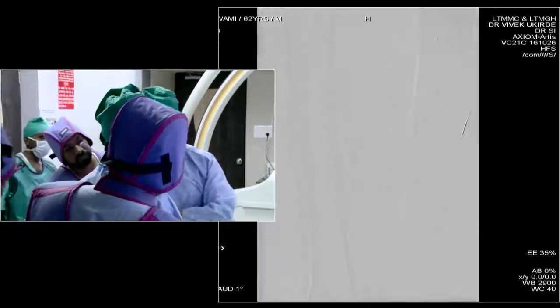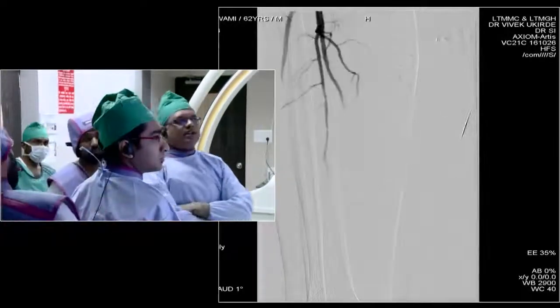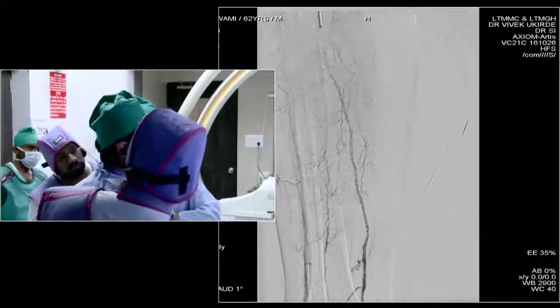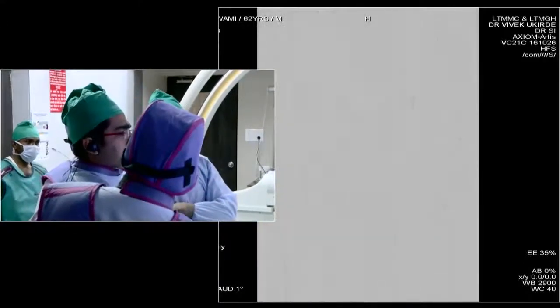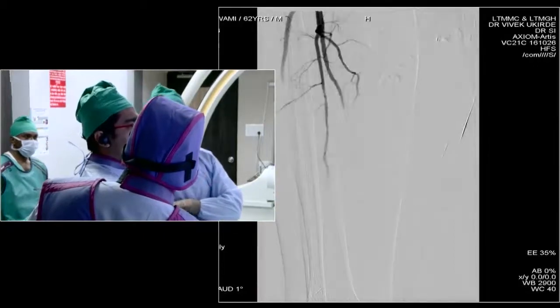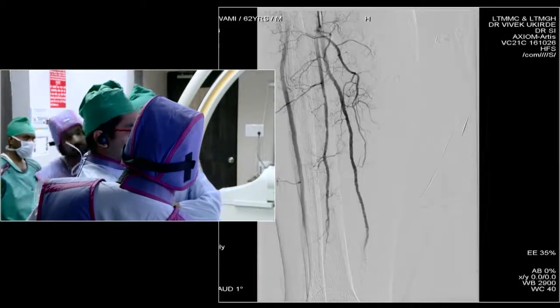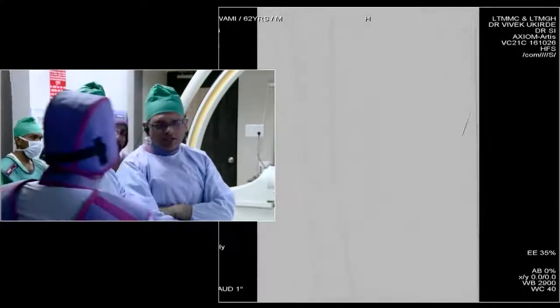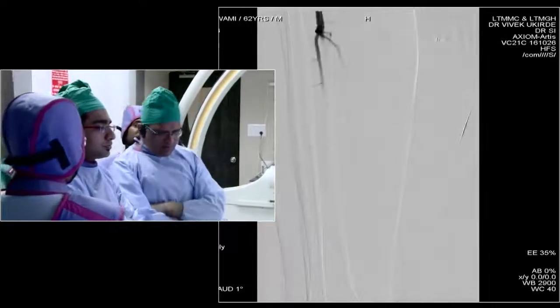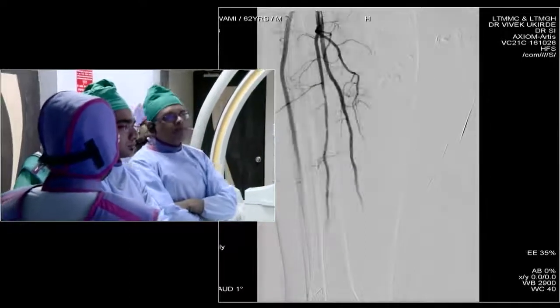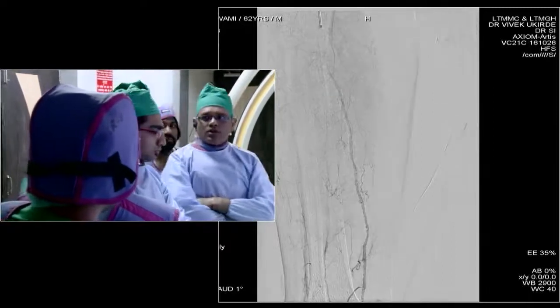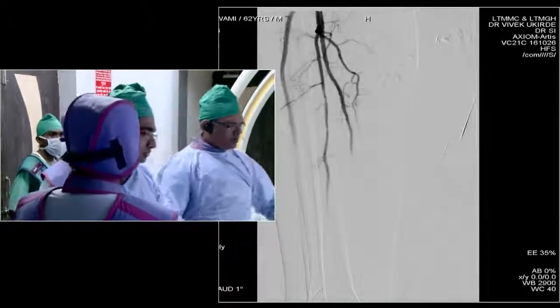Is this diluted contrast? This is diluted contrast — we always use half-strength. Since our catheter is right there, we got this run. Give me one more run, a little lower down.